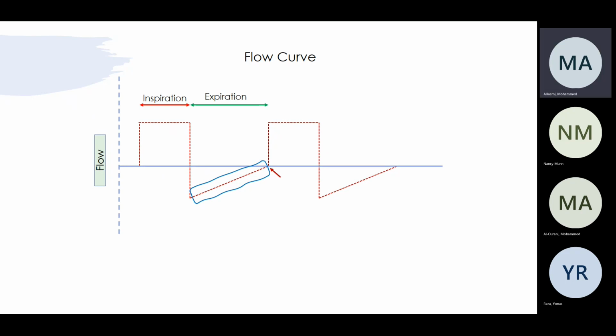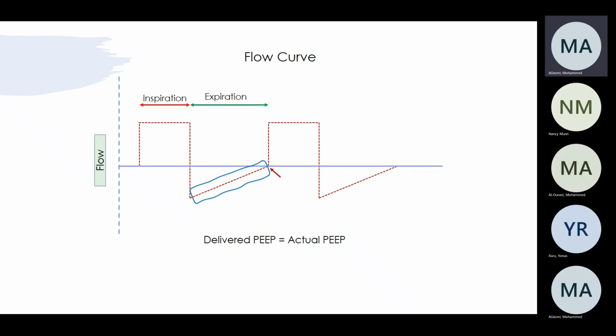That's right. When your flow is constant, that's a more accurate measurement. You took one thing out of your equation and you know more about your lung mechanics, because of the peak, how really the peak is, what the stress of the lung is. So that's why my advice to you when you're going to do calculations, and it's very important that you don't want a lot of variable changes, I will change it to a square flow, and then go and do my measurement. Okay, so that's what we call it. We didn't need to talk more about it, the delivered PEEP.